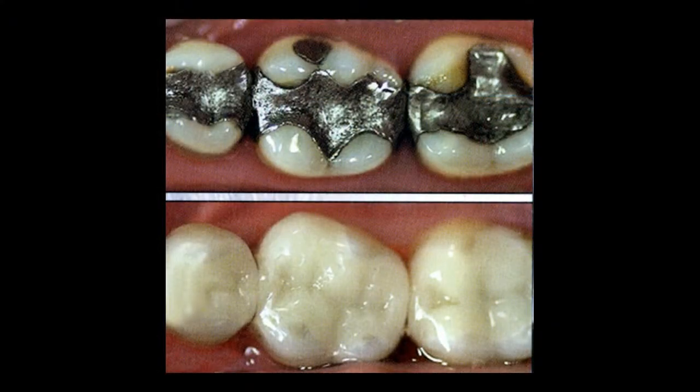Maybe it's to show the crack, show the broken cusp, maybe simply to show the ugly old amalgam that we're going to take out. If we take a pre-op, inherently we're going to follow up with the post-op, so we can showcase to our patient that beautiful direct composite, that gorgeous porcelain inlay, onlay, or full coverage crown. Whether we've done it in our office CAD/CAM or you send it to a lab is irrelevant, but to have a nice post-op picture to remind your patient of where they've come from and where you brought them, excellent.